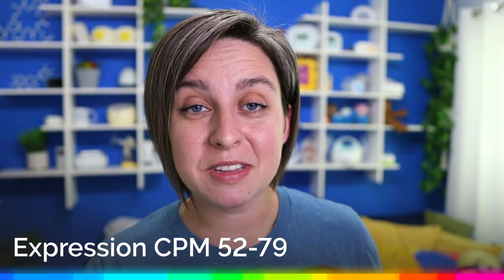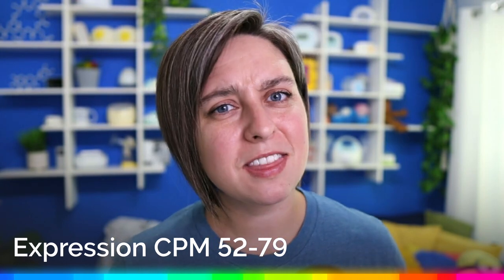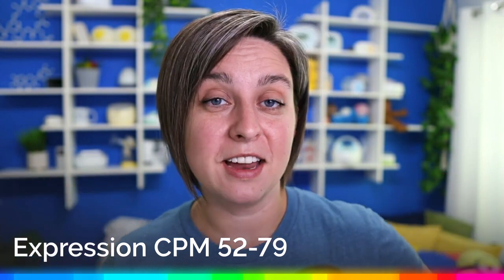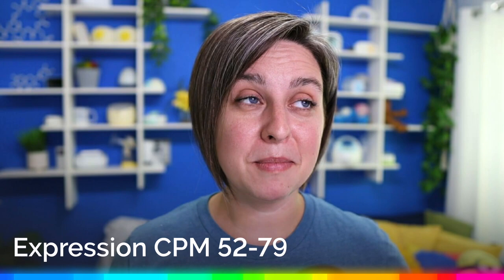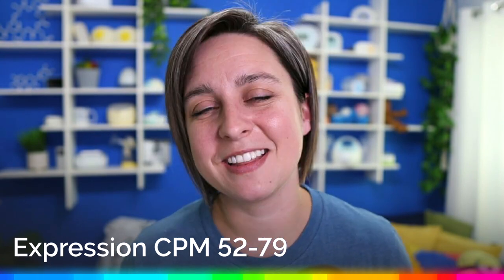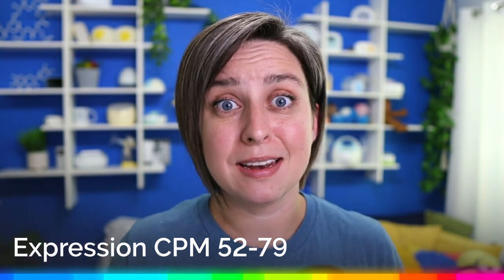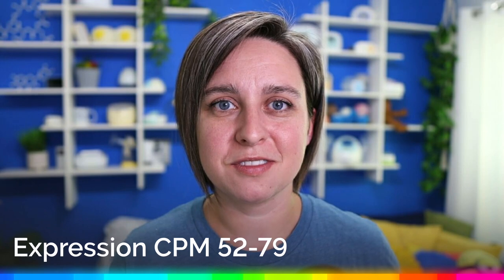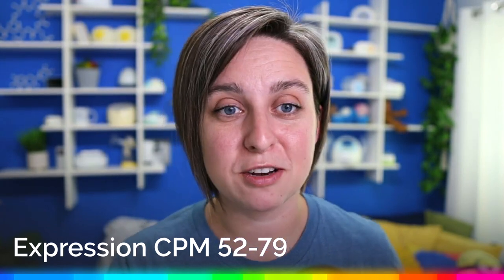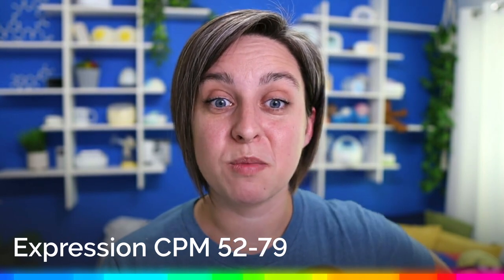In expression mode, the cycles per minute are, from my testing, 52 to 79. I think there are two different cards you can put in the Symphony, one to initiate a milk supply and one for regular use. I'm not really sure yet. I'll dive more into that later. But the one I had was set to maintenance mode or whatever, and these were the cycles that I found. I think the cycles are a little bit less in that initiation mode. I'm not sure why yet, but we can figure it out together. Anyway, that's the cycles per minute that we're looking at.